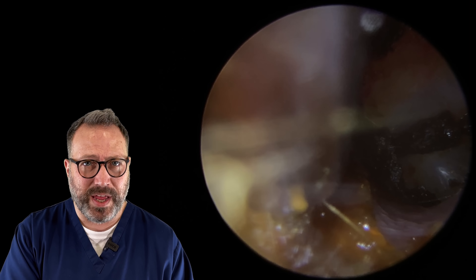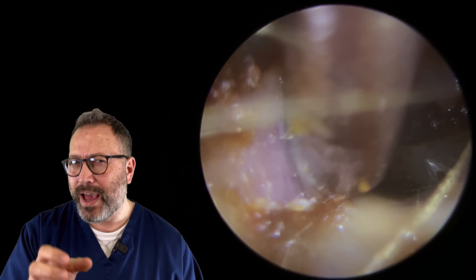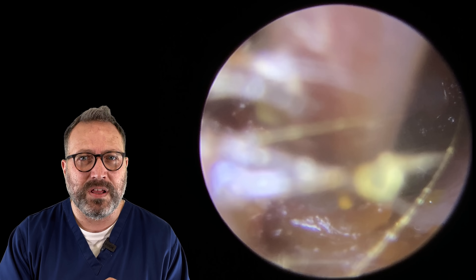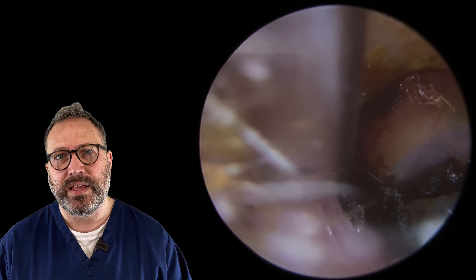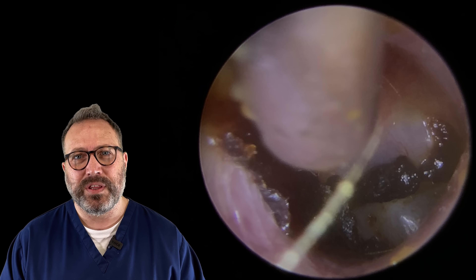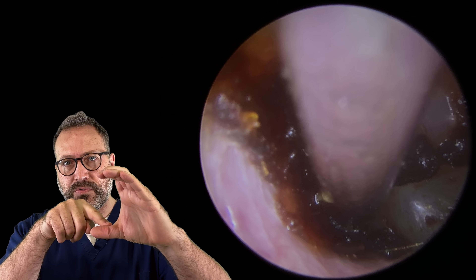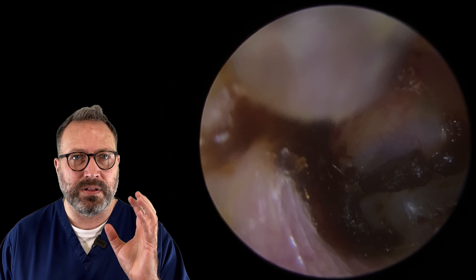We're okay on this outer section of the ear canal, but when you get to the deeper sections closer to the eardrum it can be quite uncomfortable for the patient - they may feel almost like a sharp sensation when you're taking that away. As we're getting closer down here we've got another peel - it went down one side, doubled back, and peeled up the bottom end. There's a very thin layer to the left side, so we're just going to tease some of that off. We're going to need to try and take some of this left-hand side wax away. If we can expose this eardrum, this patient is going to be hearing a lot better.